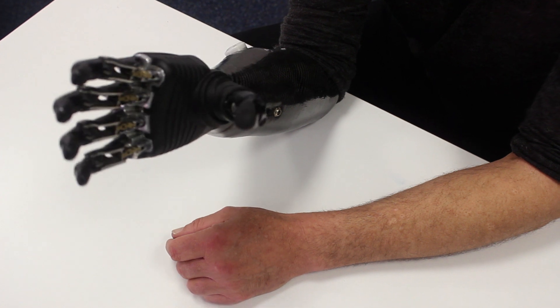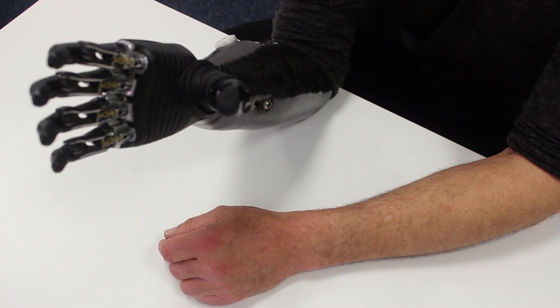They wanted all the prosthetics to do things exactly the same. It didn't even come into the conversation that all amputees are different, all people are different. When you get something that's the same, you're taking away your individuality. It's trying to get away from the engineering mindset and into the human mindset.